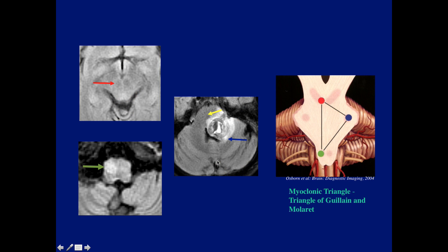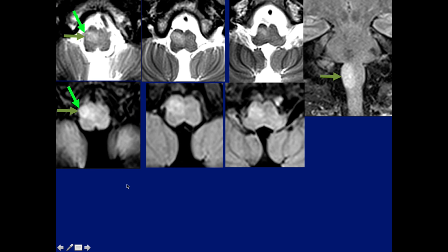If we now look at the case I showed before: this is the region of the dentate, and here we see the red nucleus may be a little less dark than its companion, and then we see the changes in the olive. These are the structures involved by the components in the triangle.